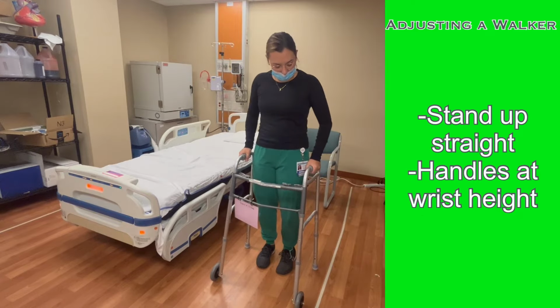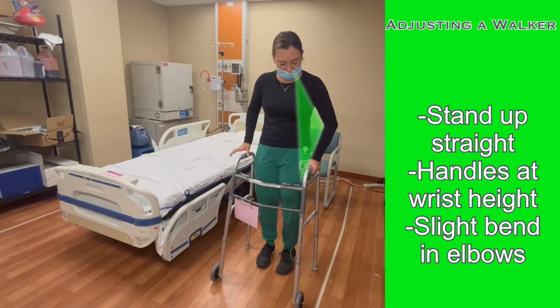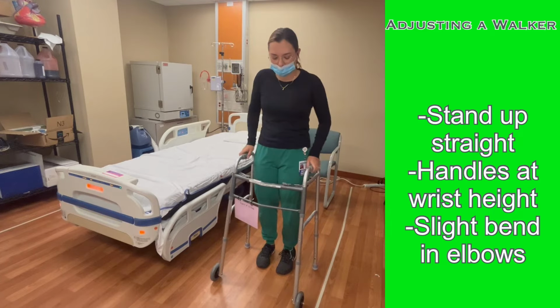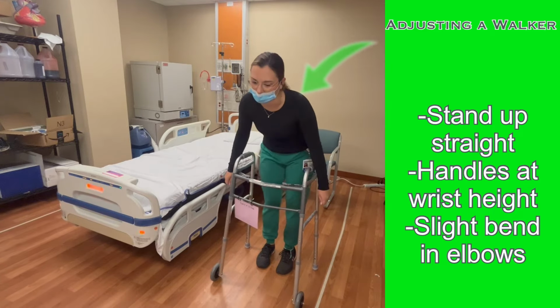With the walker at the appropriate height, the patient will have a slight bend in the elbows when using the walker. This will help to support the patient as they walk and help the patient maintain better posture with better balance. If the walker is too tall, the bend in the elbows will be more drastically angled and make it more difficult for the patient to use the walker to support them as they attempt to ambulate. If the walker is too low, the patient will be forced to hunch to hold the walker. You will see that slight bend at the elbows disappear, and the hunched posture makes it more difficult for the patient to balance.